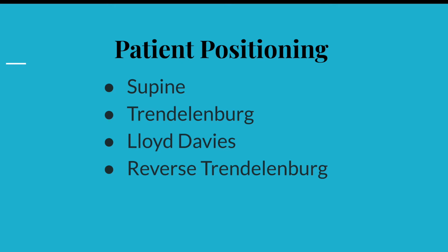First and foremost, patient positioning is an important initial preparation prior to commencing laparoscopic surgery or even any surgery. The main positions that we will come across today are supine, Trendelenburg, Lloyd Davis, and reverse Trendelenburg respectively.